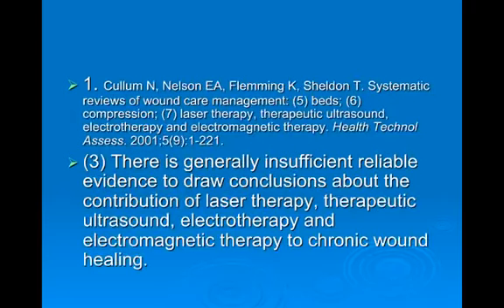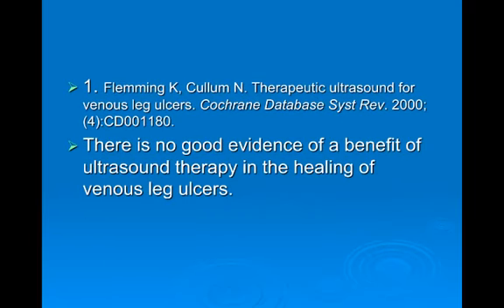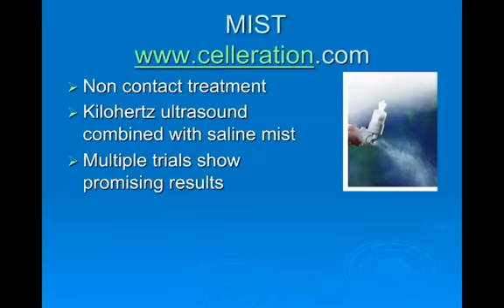Okay, and let's pop back to the other one here. This was reviewing various things for wound management. They looked at beds, compression, laser therapy, therapeutic ultrasound, and again, generally insufficient reliable evidence about therapeutic ultrasound. Okay, so wound care, definitely the jury's out. Need more research here for using this for wounds. Okay, so moving forward here, another one from the same set of guys, venous leg ulcers, no good evidence. Okay, so you're getting the idea.